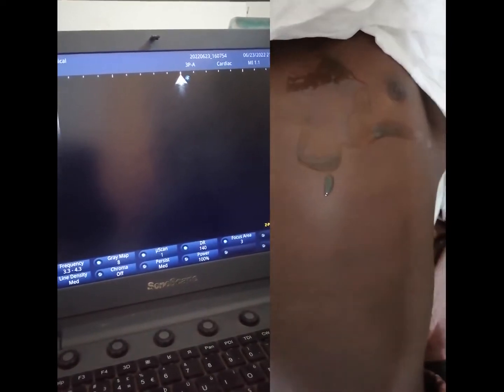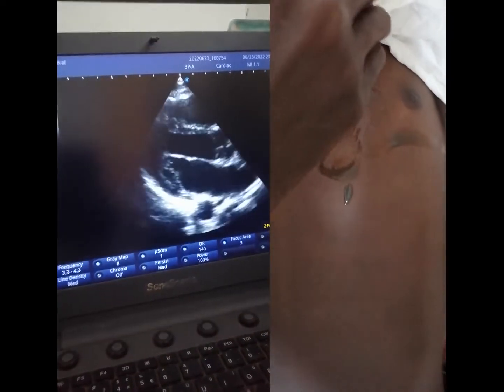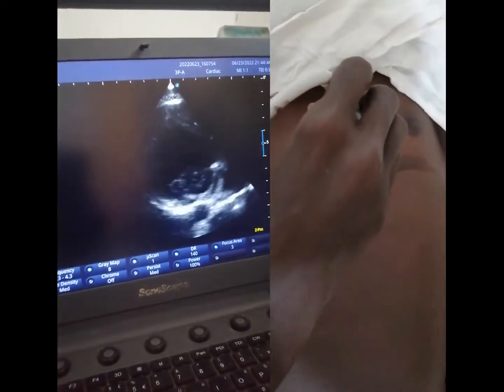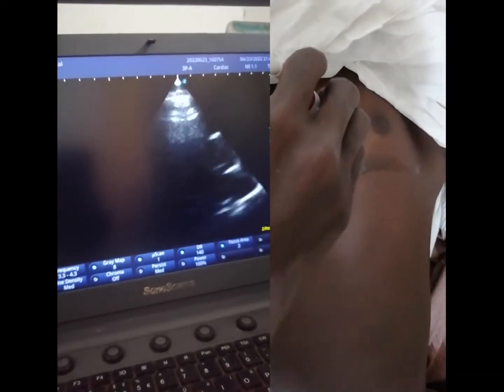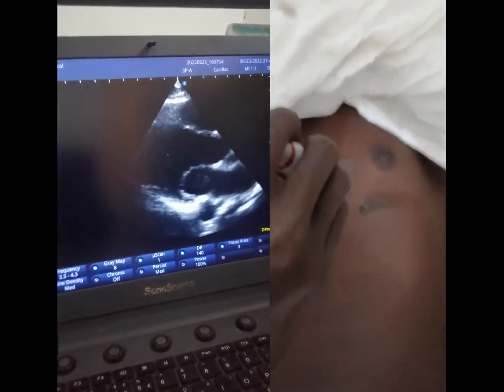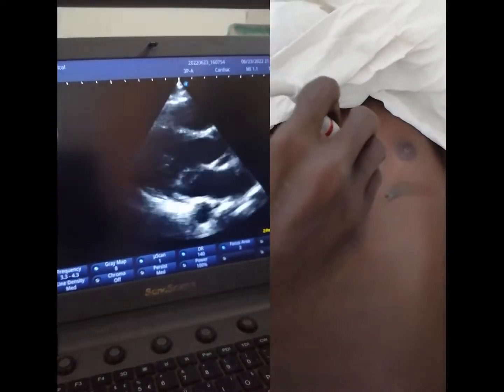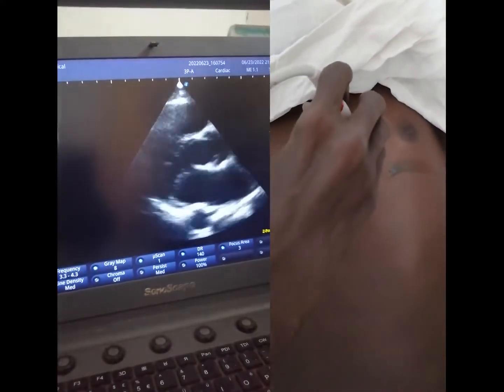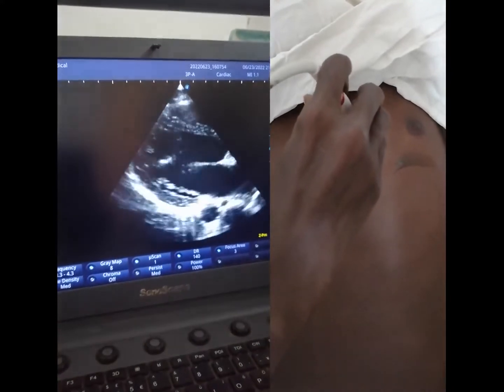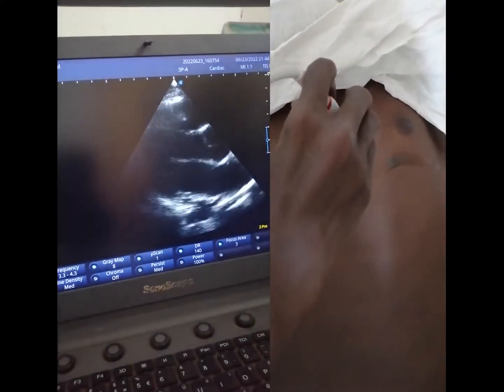We are going to start from the second intercostal space and then rotate our marker toward the right shoulder, so that way we can get the best view of the parasternal long axis.